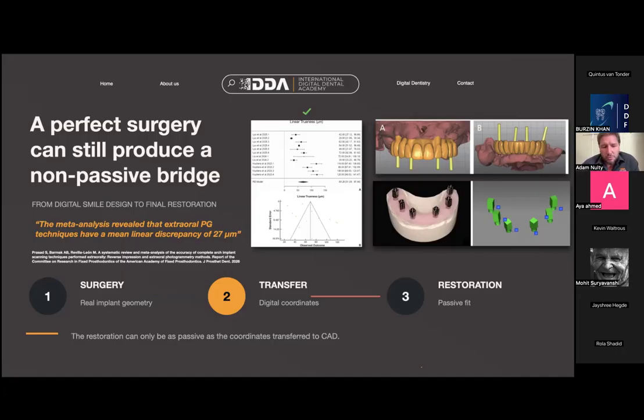And when we're talking about 3D facial analysis, the reason why I say this slide is because that also brings in the issue of we like to use the end result at the beginning. And if we're retaking data at different points, we need to be able to use all of that previous data within that data set that we've re-recorded. But obviously, again, error can creep in the combination of that data. So making life easy in terms of having points within the data sets to be able to combine the data makes everybody's life easier.